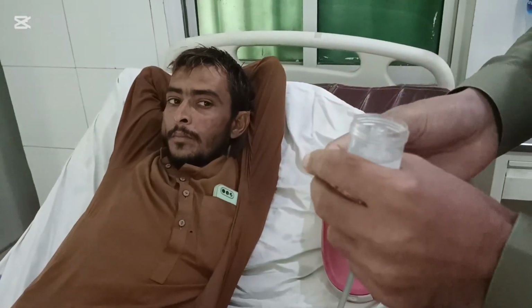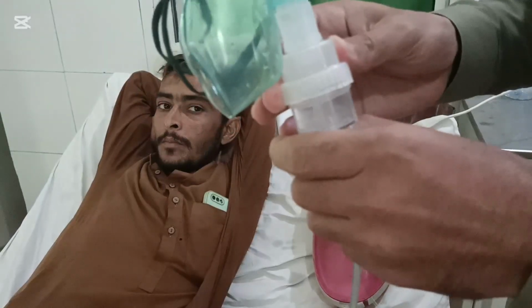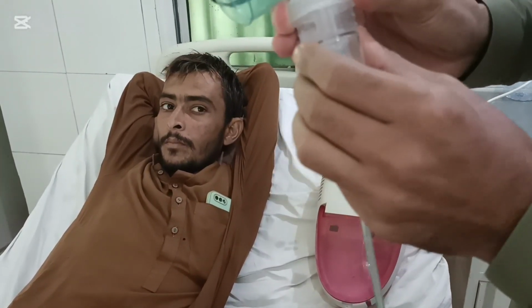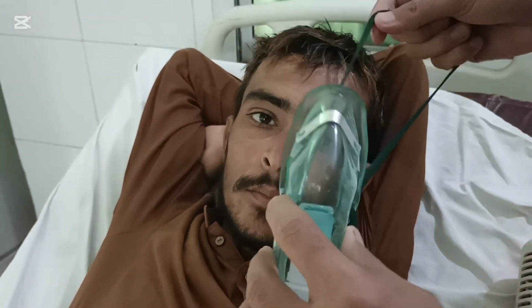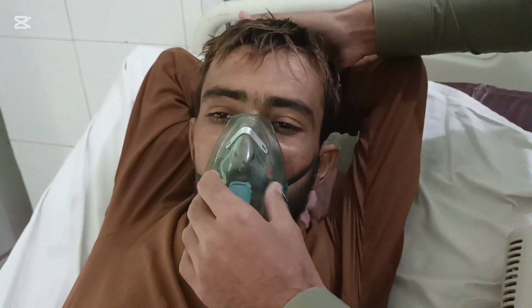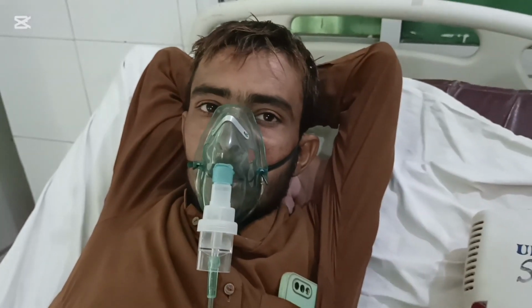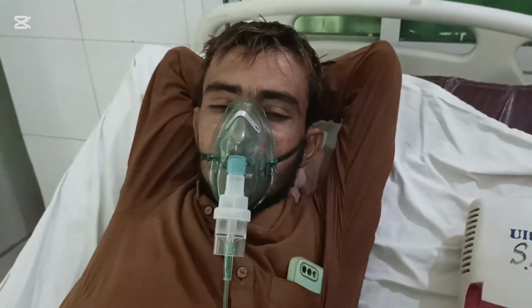Now I have placed the medication into the medication chamber. Now fit the face mask over the medication chamber. Now fit the face mask to the patient's mouth. We have two types of face mask. One is child size, the other is adult size. This is the adult size face mask.